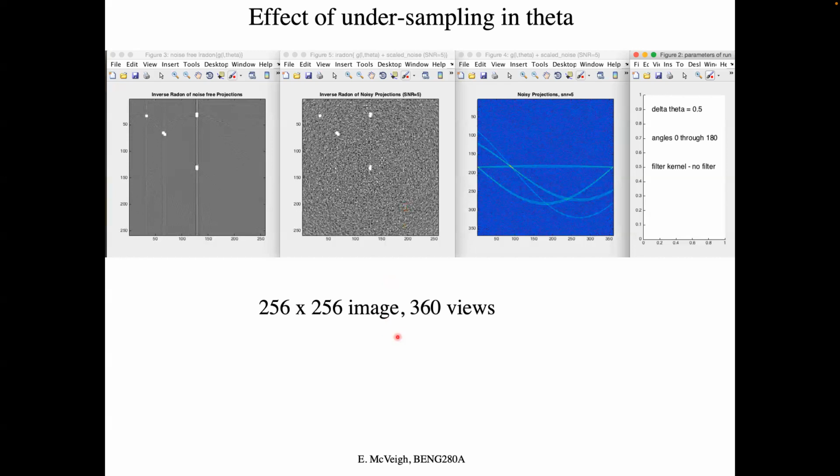But eventually, as we go to higher and higher numbers, I don't know if I have a higher one here. Well, I do. Look, here's 720. So things do change a little, right? But principally what is happening here, because I haven't normalized to the number of photons per projection, is that the noise just went down.